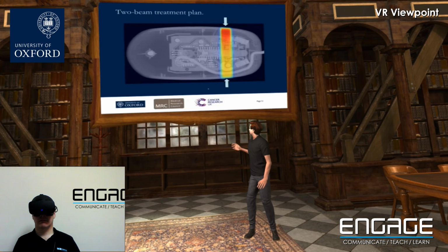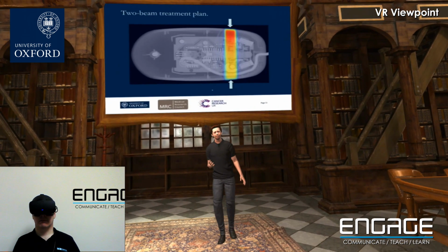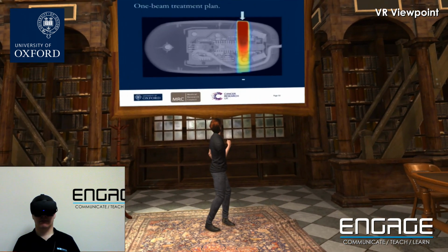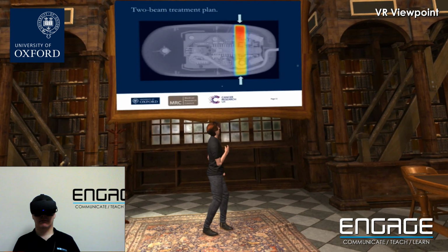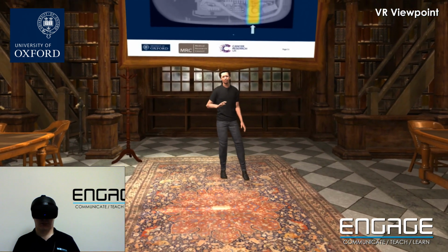It's still not great. We've still got a lot of damage here, and that's not where the tumor is. But look how much less damage is being done there than in the previous slide. Go back. Compare that to that. This is still not good. I mean, we don't want to do this, but it's a huge step forwards.